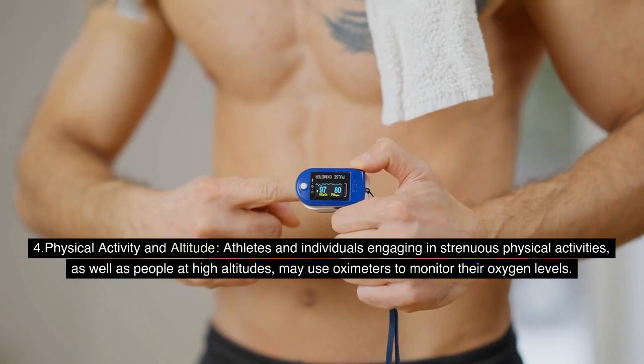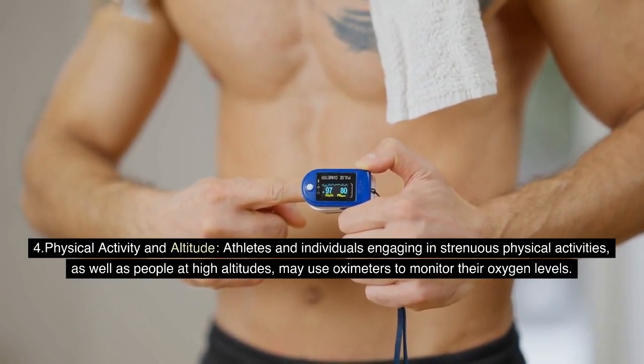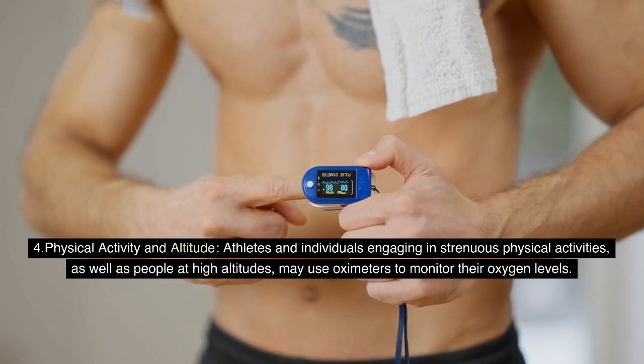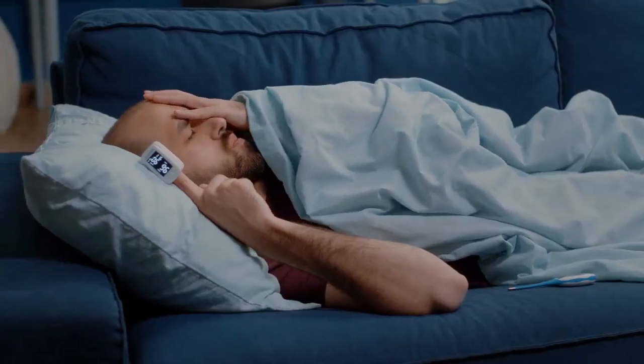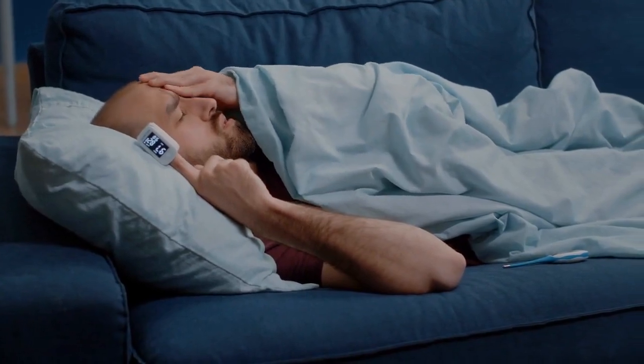4. Physical activity and altitude. Athletes and individuals engaging in strenuous physical activities, as well as people at high altitudes, may use oximeters to monitor their oxygen levels. This can help prevent altitude sickness and assess the impact of physical exertion on oxygen saturation.